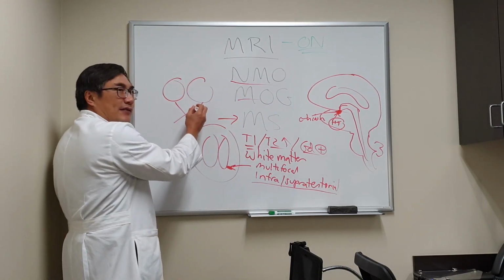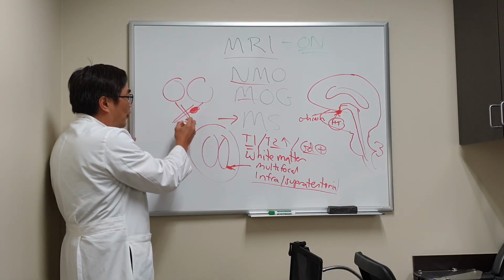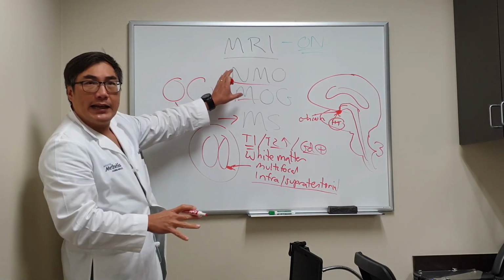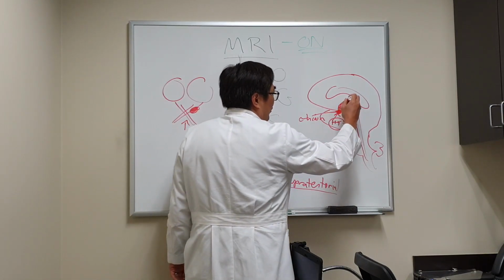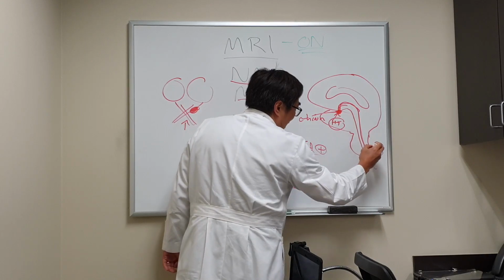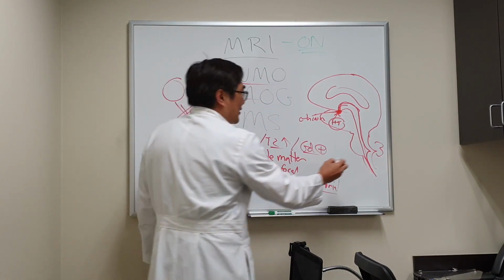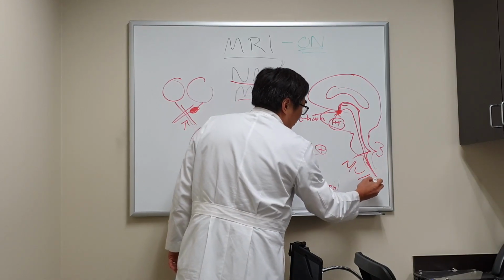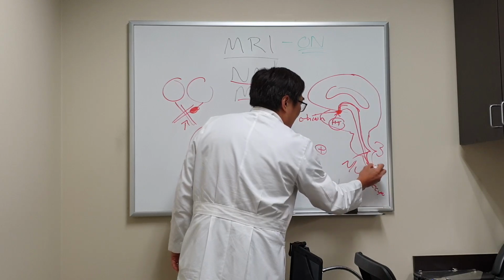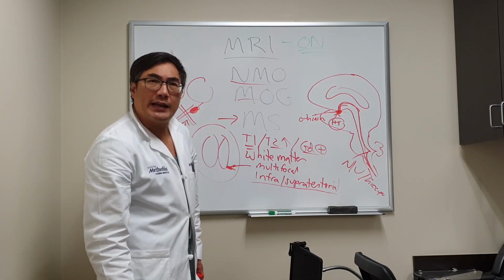And so instead of just a focal lesion like this, you'd have longitudinally extensive or chiasmal enhancement in the NMO pattern of optic neuritis on the MRI. And then if you just drew a little line around here, you go all the way down to the area postrema, which is where the vomit center is, and that's going to produce the nausea and vomiting. And in the brainstem, that's going to produce the intractable hiccups. And then the periependymal areas are where the enhancement's going to be.